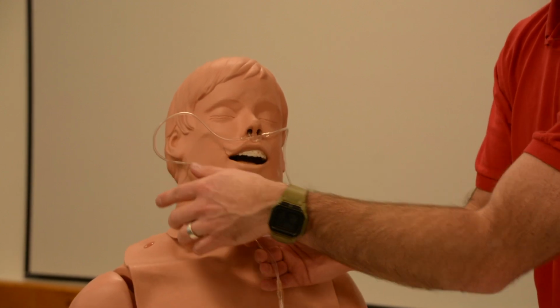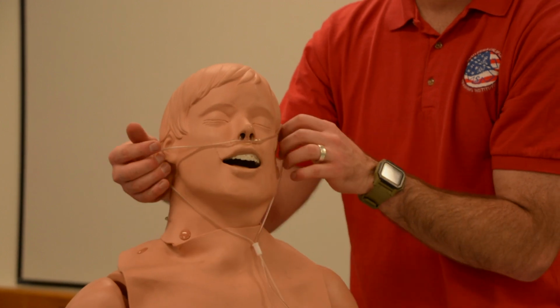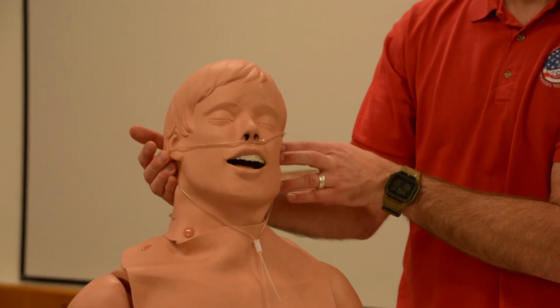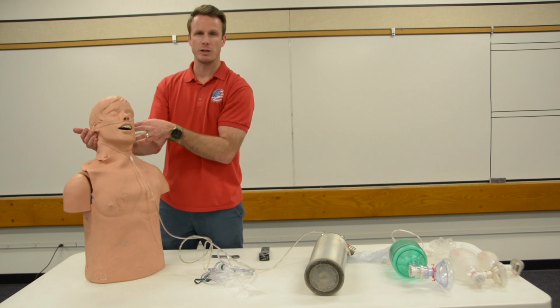And it's going to tie up right underneath his chin, just like that. And it's going to be held onto this patient's face, right? And he's going to be able to get low concentrations of oxygen, and it's going to be able to support his breathing or his circulation.